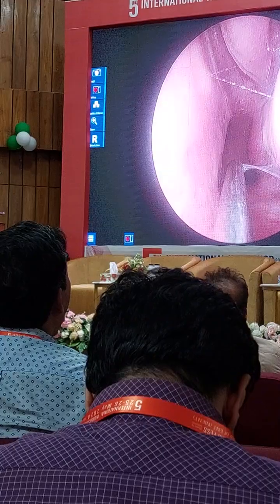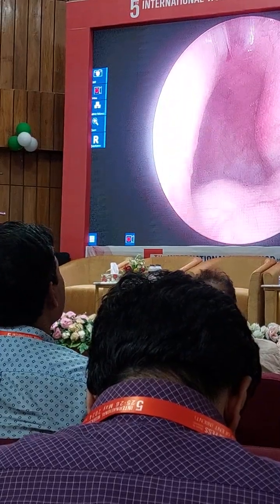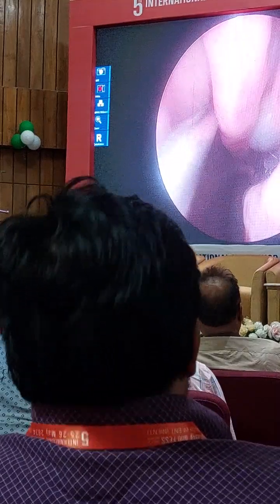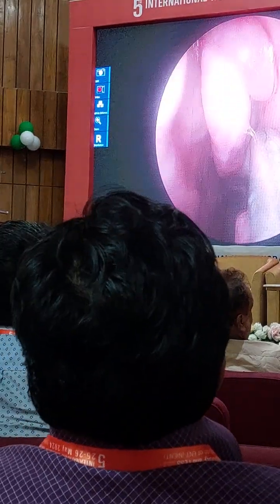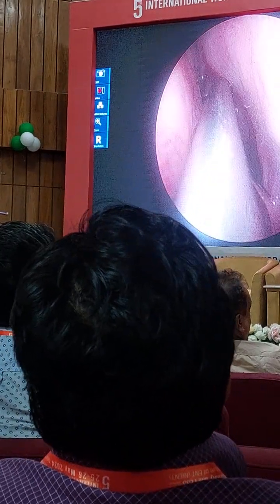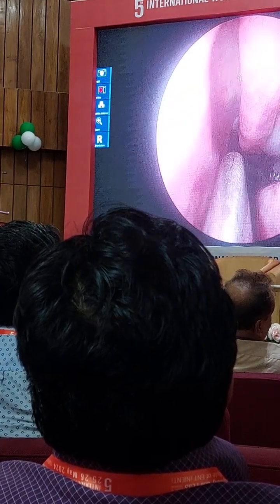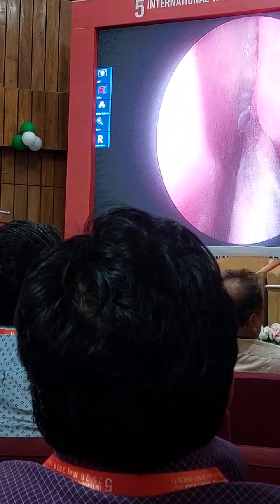Lot of mucus in there. Okay, nasopharynx, soft tissue, middle turbinate. We have polyps in the middle meatus. All the way up. Little bit of a deviation, but I think we should be okay with that. If you look medially again, we have more polyps here.